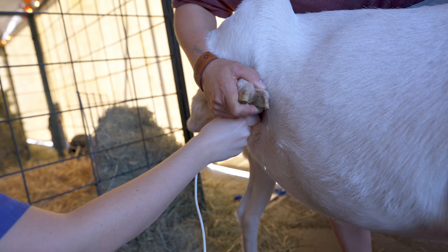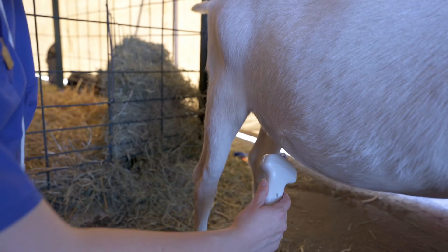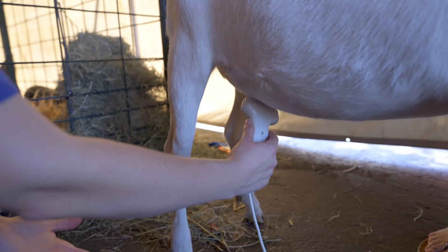You can do the same from the left hand side, and another position is in front of the udder. Particularly if the pregnancy is quite early, you can try looking from this position as well.